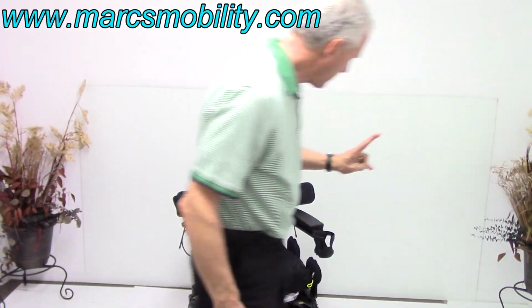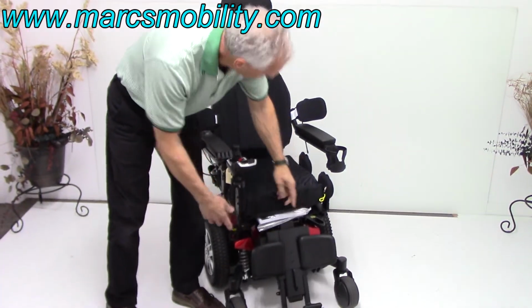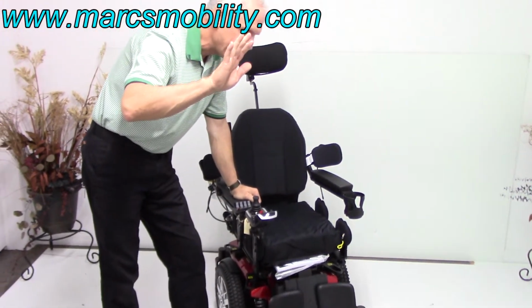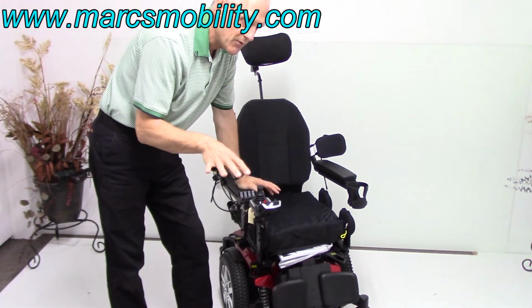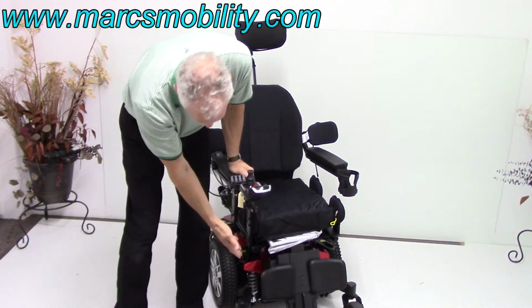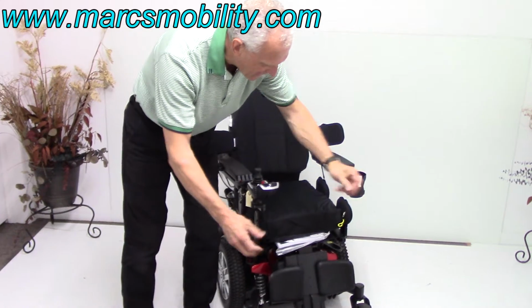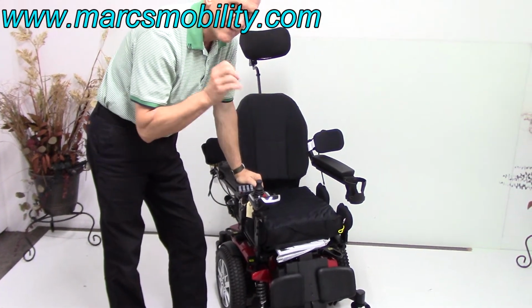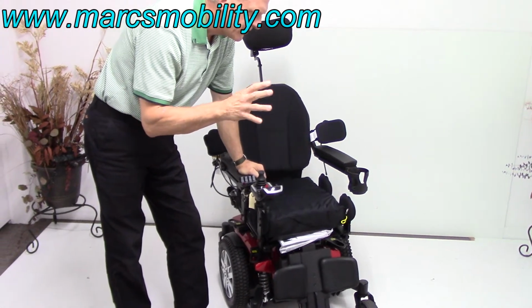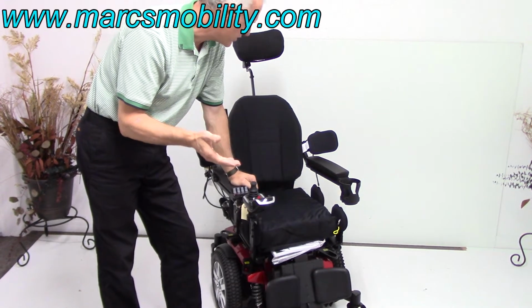This chair takes 2 batteries. The batteries on these power chairs come out from the front. You don't have to take the whole seat off, but they do come out from the front. So you have to have the seat tilted back or whatever. Don't wait till the batteries are completely dead because you're not going to be able to get the batteries out. But if you need to replace the batteries, they come out from the front. There's 2 levers you push in, the whole front end comes out, and it takes 2 55 amp batteries, group 22, and they'll give you about 13 to 15 miles on a battery charge, depending where you're using the chair.